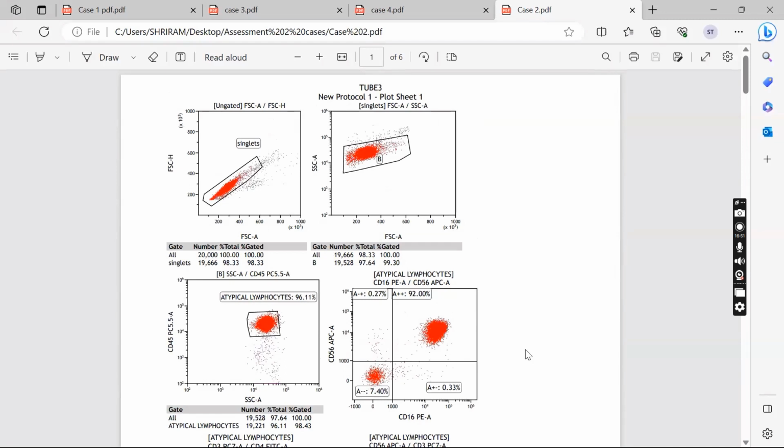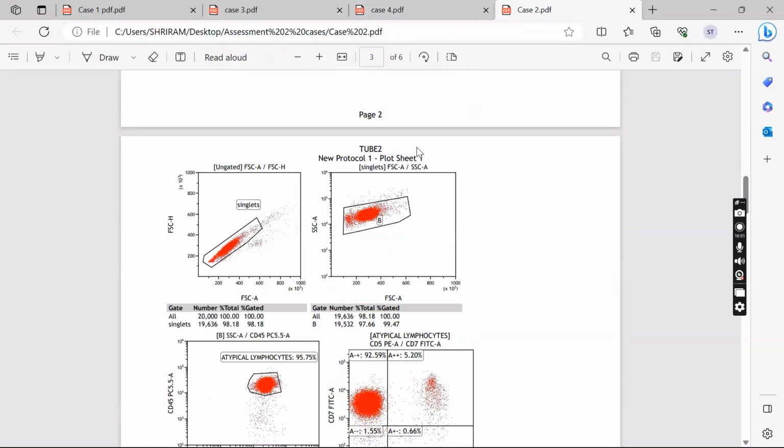So this is a monoclonal gammopathy of renal significance because the renal impairment has been documented. So this is MGRS. Okay. So this case is an MGRS. But I don't expect you to give this as a diagnosis in your results because I have not given you the history. So without history, this case cannot be labeled that. So that's fine. So the people who have given it as abnormal plasma cells, I'm fine. LPL is not acceptable.